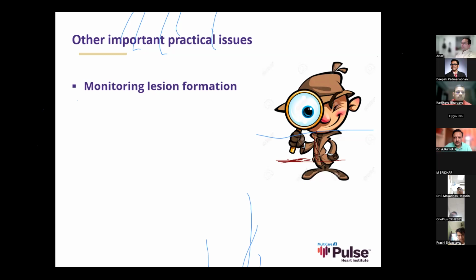Oh, the MiFi catheter. Yes, I think they have small micro electrodes at the tip, which are designed just to measure the impedance between them. So they have 2 or 3 electrodes right at the tip, and they measure the impedance right between the tips. That's how they measure the local impedance. I have never used that catheter. It's not super popular here, but it exists. It doesn't have contact force, so that's why nobody likes it.